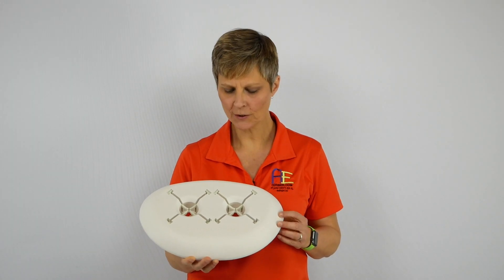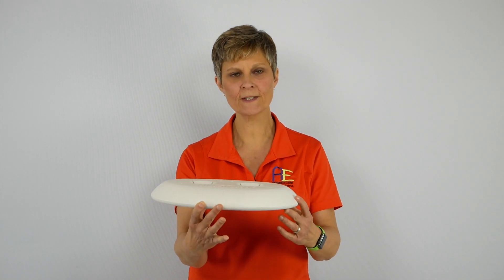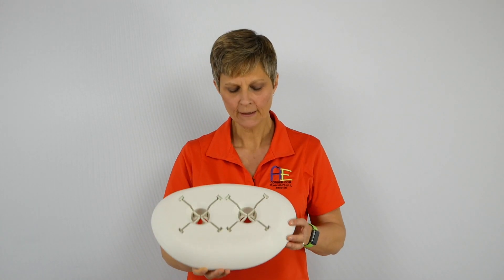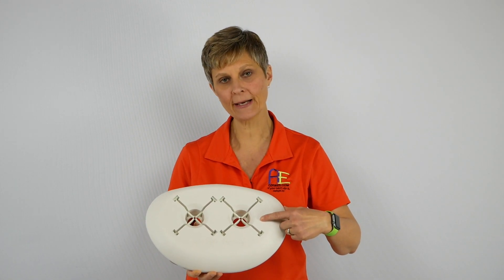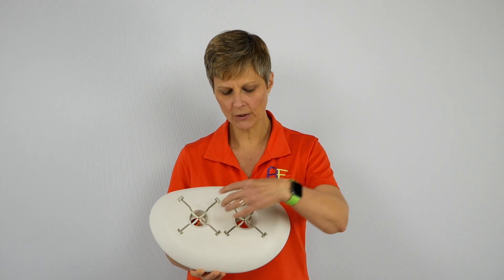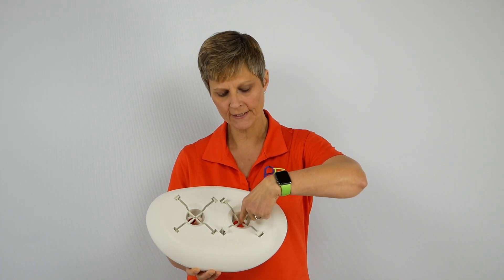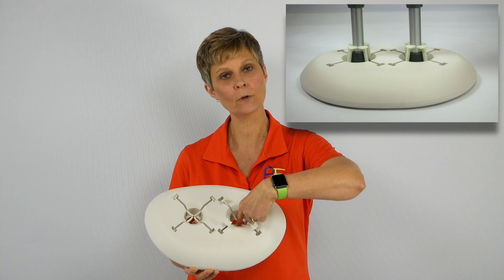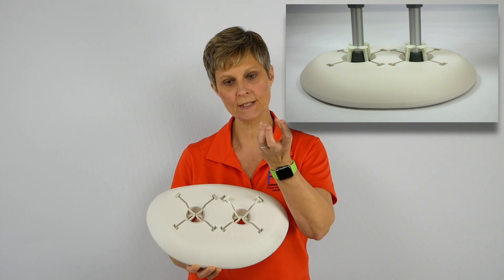So this is the Crutch Caddy. As you can see, it has a nice base. It's a little bit weighted and will sit like this on the floor. Inside we have two circle areas called the lock and release mechanisms. This is the area where you set the crutch tips down into, and four lever arms come up to surround the end of the crutch to hold it stable.